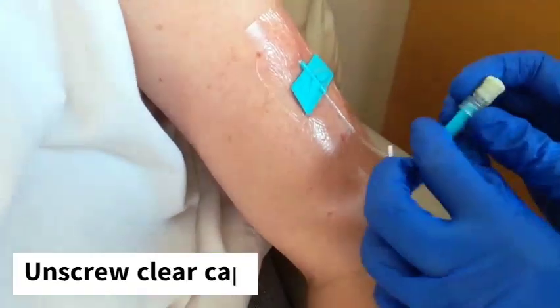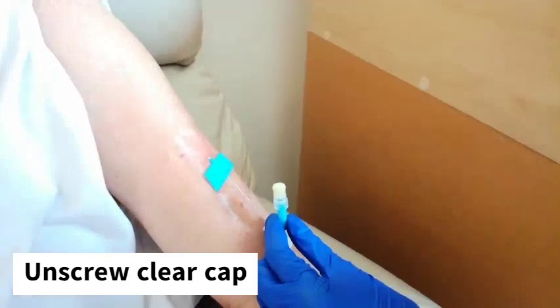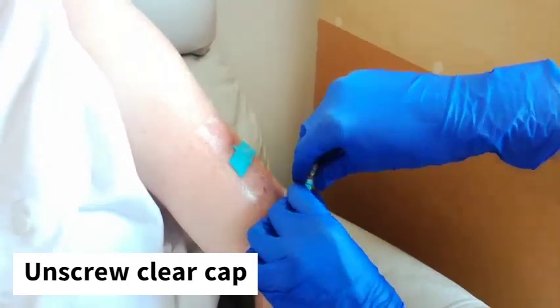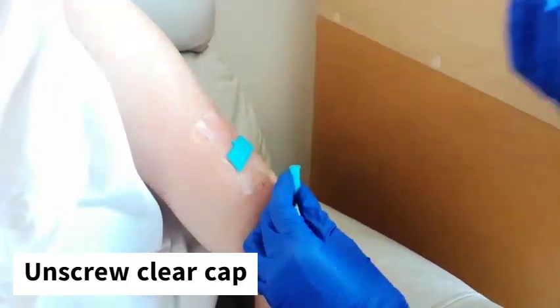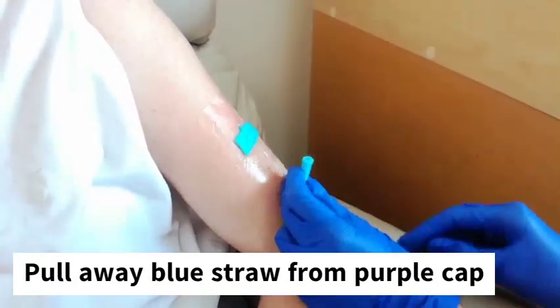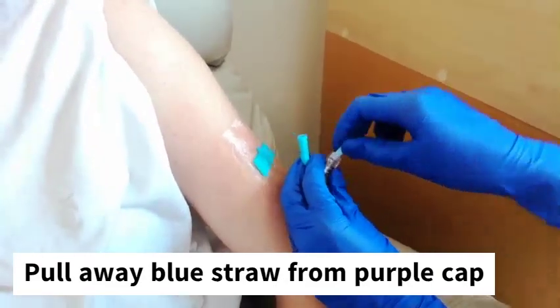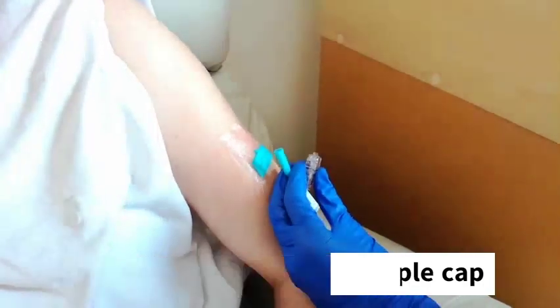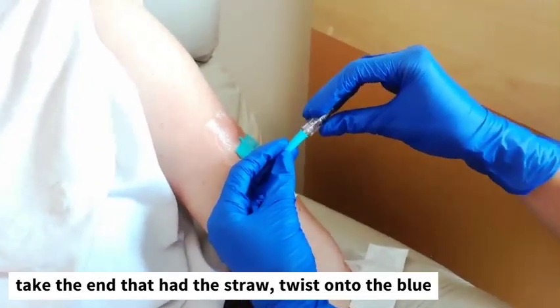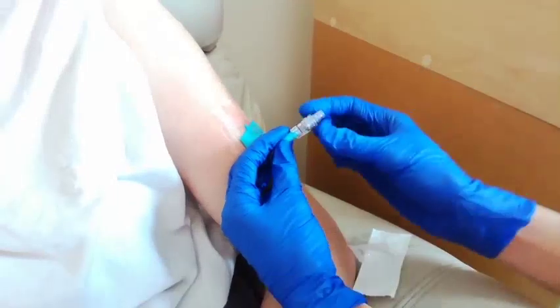Now we need to remove this cap — the clear part — and replace it with our purple cap, which is easier for us to inject medications with. We need to do this in a clean manner. So we'll hold the blue and remove the clear by twisting firmly away and removing that out of the way. Keeping the blue section safe and in the air, we're going to take our other cap, hold and remove the plastic straw tubing, then connect it with the blue by pushing in and twisting firmly again. Now this end is ready for your injection or your syringe to connect to it.